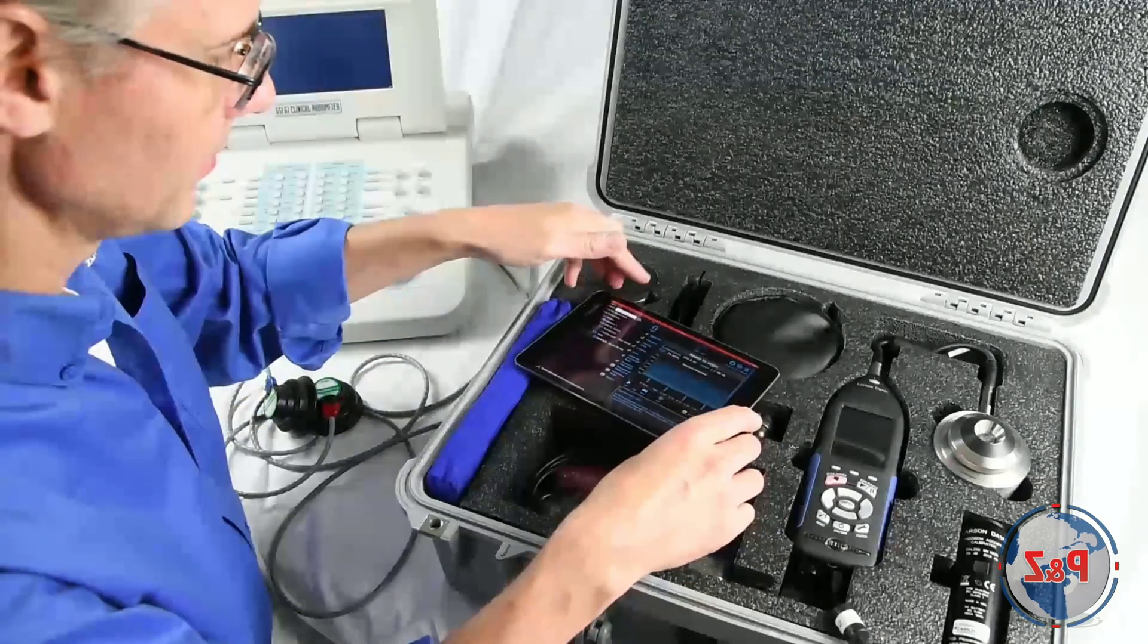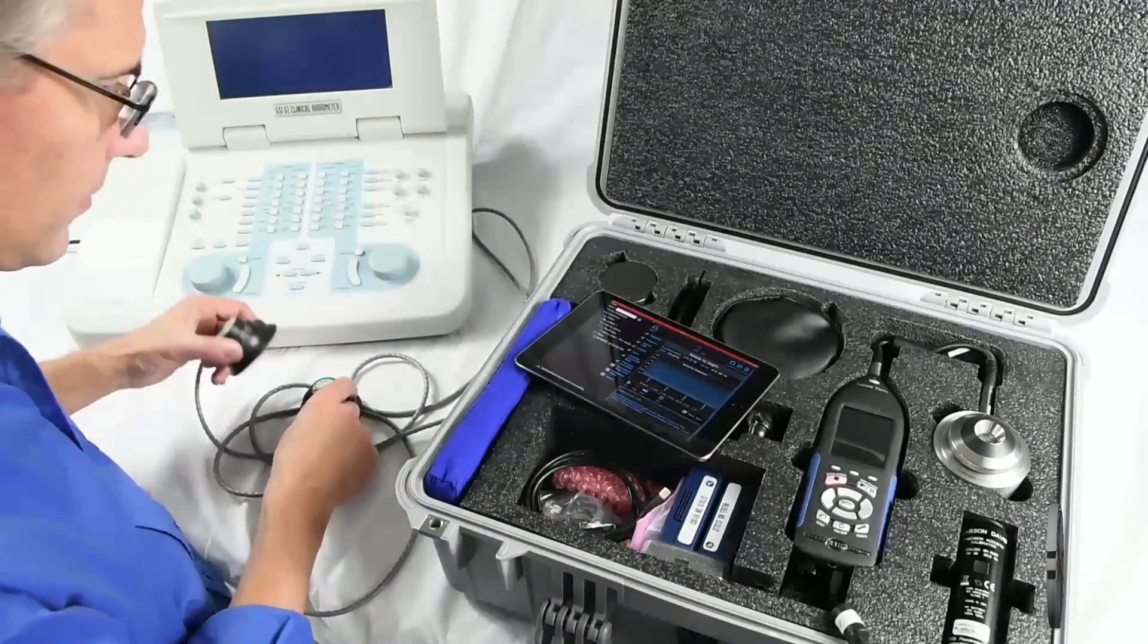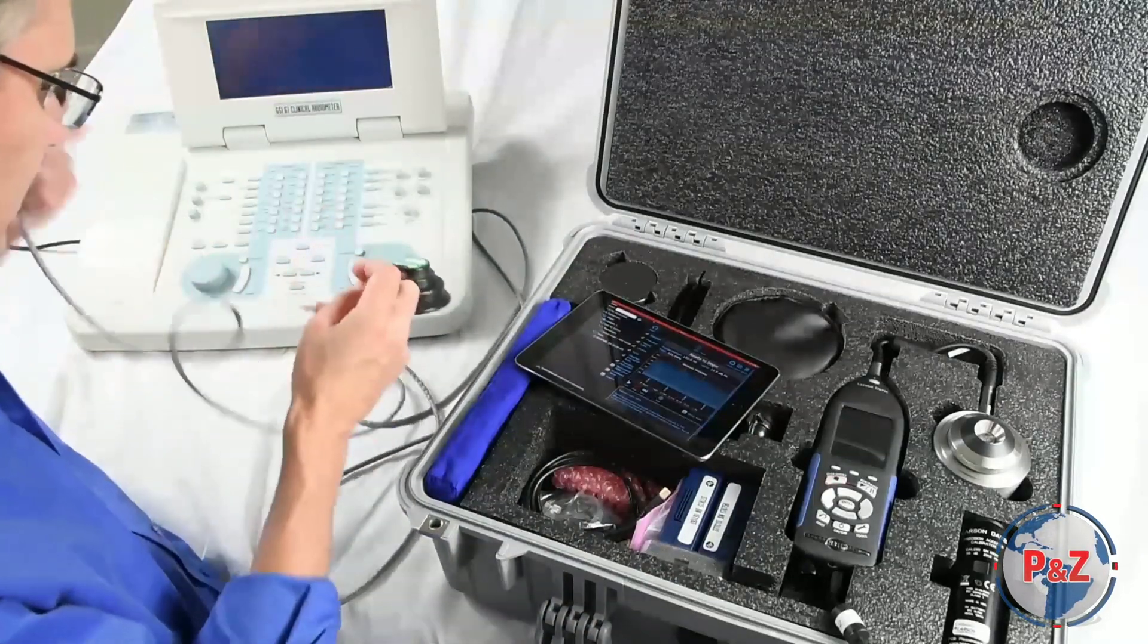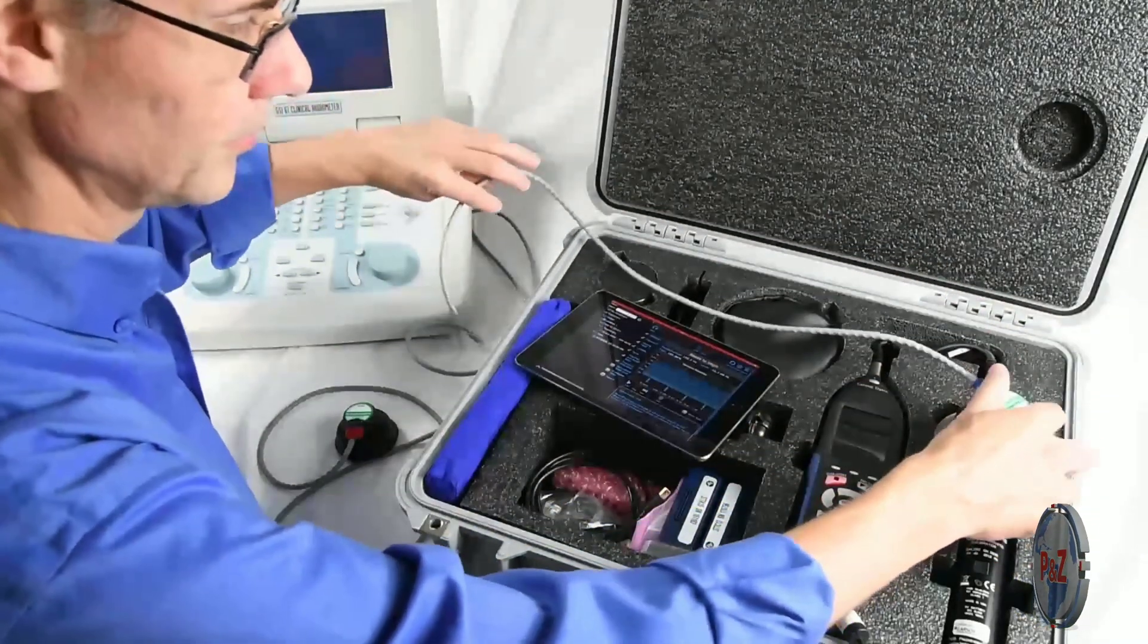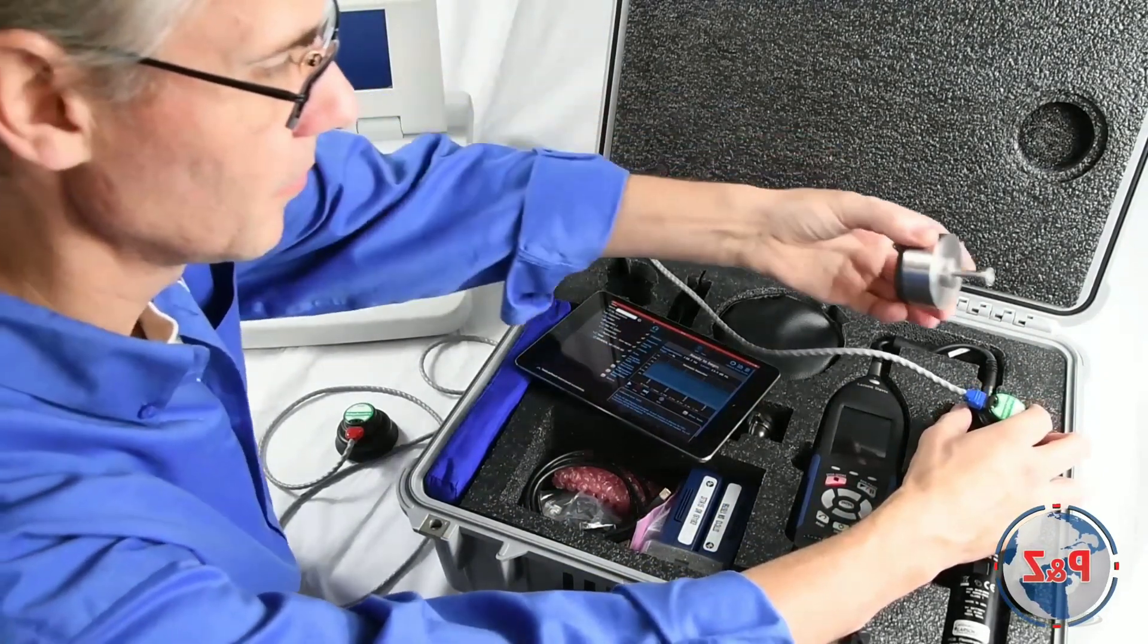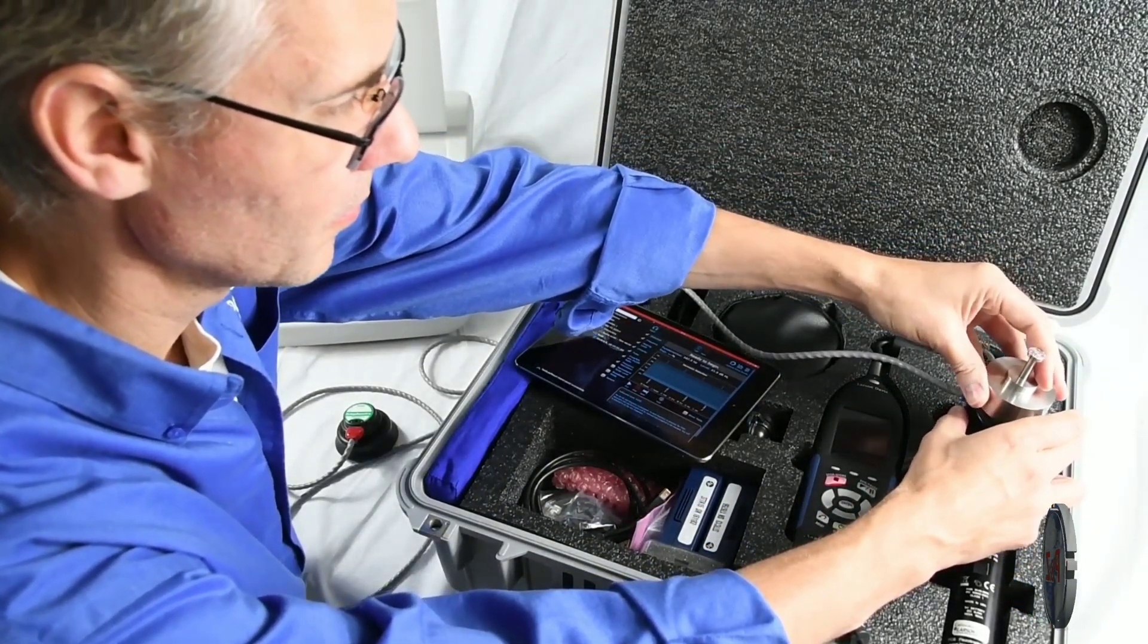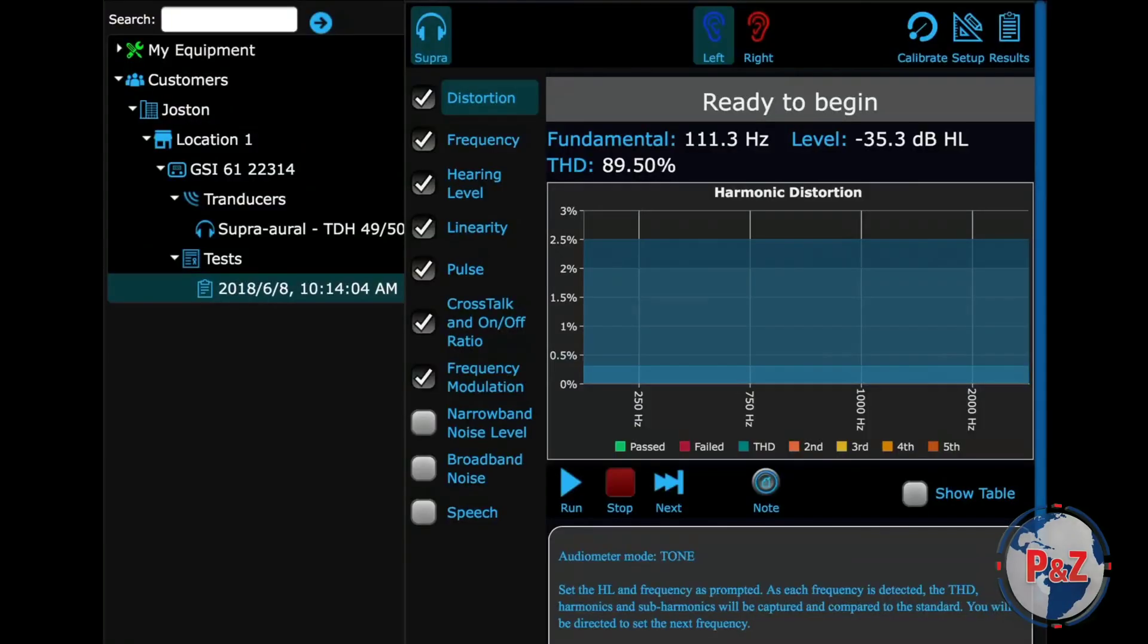OdCal was designed to be tested in the case, so you can leave the coupler in the foam during the test. For this test, Brent is going to place the left supra-aural headset over the coupler and secure it in place with the mass handle weight.